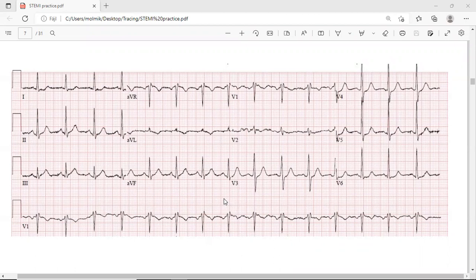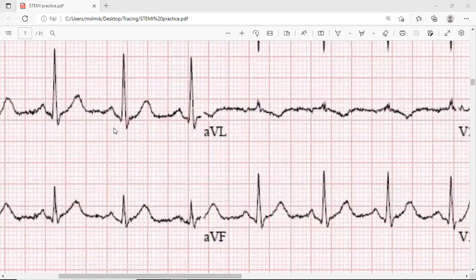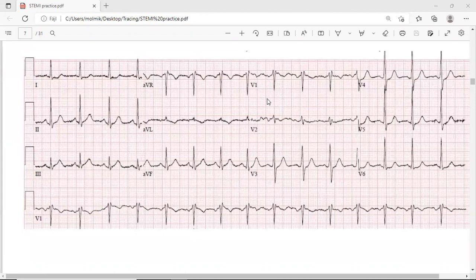Is it acute? I don't think it's acute, it can be hyperacute. Okay. And an additional one, if you look at V1, there's an RSR complex, but the QRS complex is not wider. So I would say maybe it's an incomplete right bundle branch block. It looks like a little bit wider S wave is here, but that can be a normal variant in V1, so it's not a right bundle branch block. The incomplete right bundle branch block is very common, it doesn't mean anything. So that's good. Okay. All right.